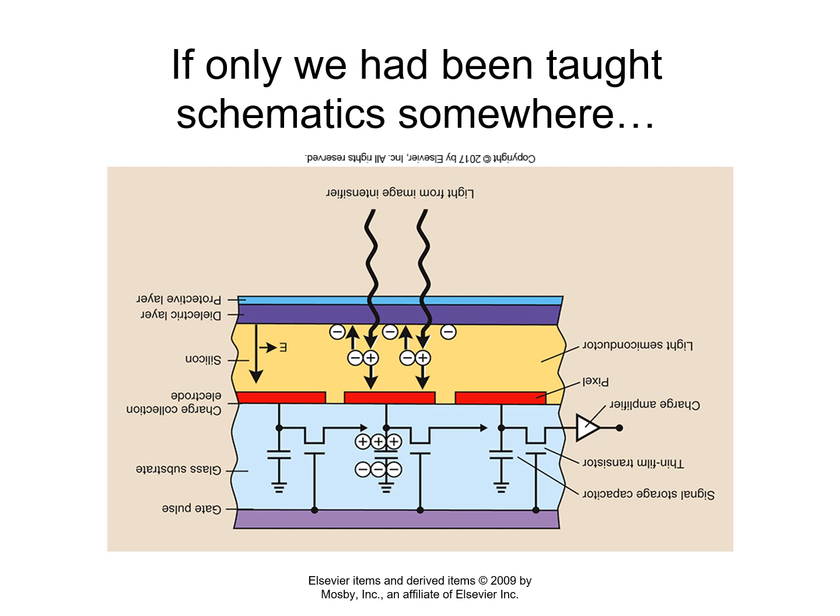That's exactly how the CCD is moving the charges off of the pixels. Row by row, we're shifting the positive charges from one storage capacitor to the next row of pixels over, until you get all the way to the far right hand side of this diagram. The last row of pixels always dumps their positive ions to the charge amplifier.